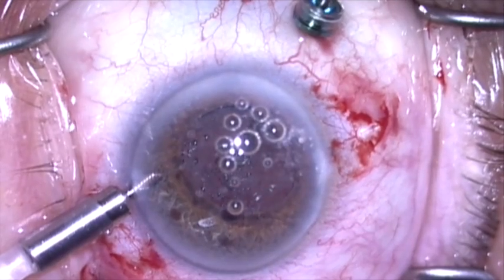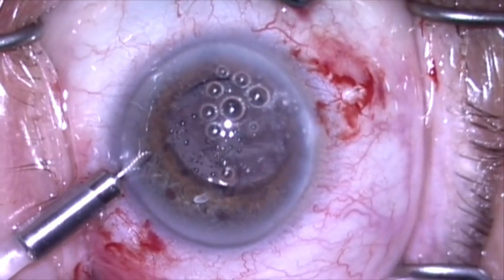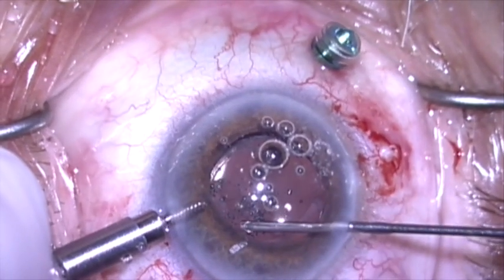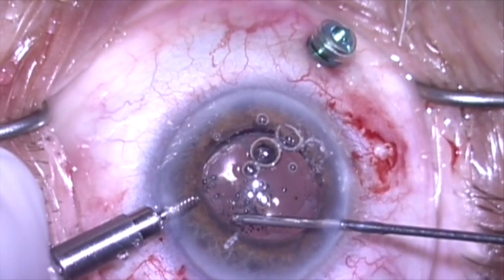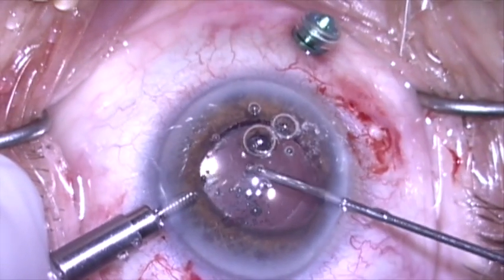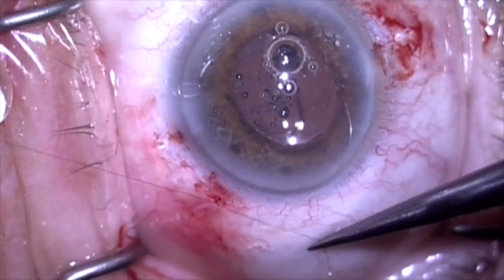You can see the vitreous coming into the tip of the vitrector. There's a small wisp here in the anterior chamber, so I'm going to come through the paracentesis with the vitrector and remove this. Now the vitrectomy is completed.